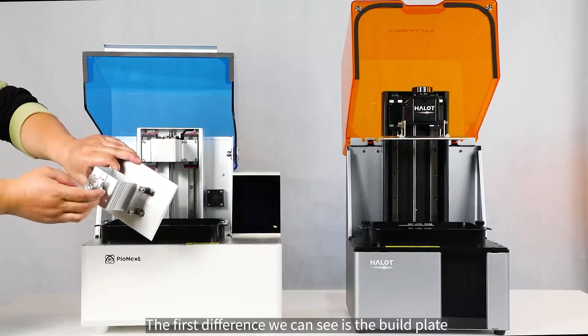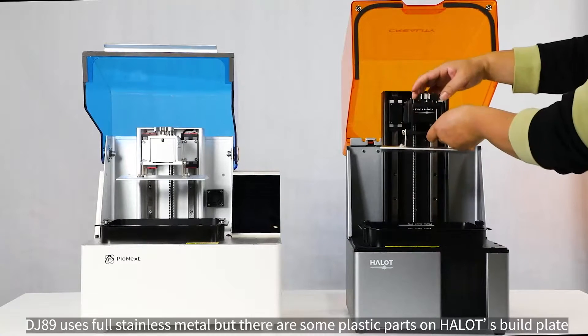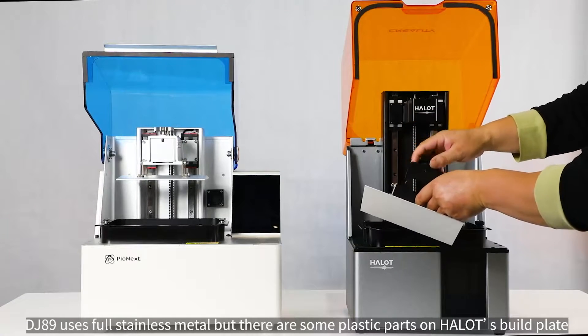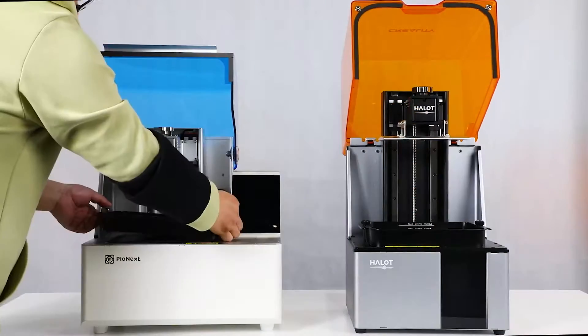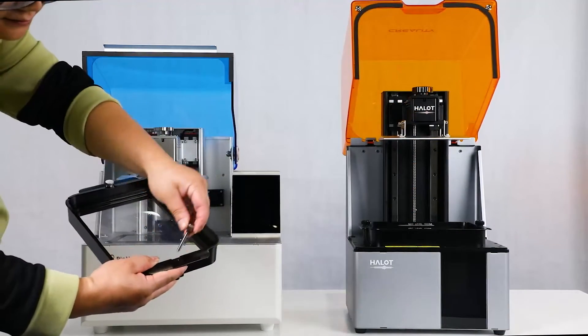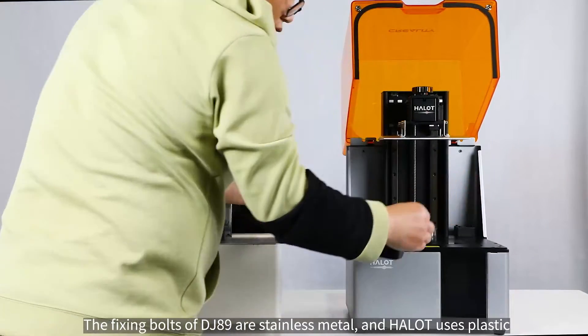The first difference we can see is the build plate. The DJ-89 uses full stainless metal, but there are some plastic parts on the HALOT's build plate. The fixing bolts of DJ-89 are stainless metal, while HALOT uses plastic.